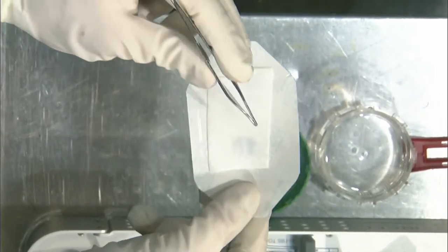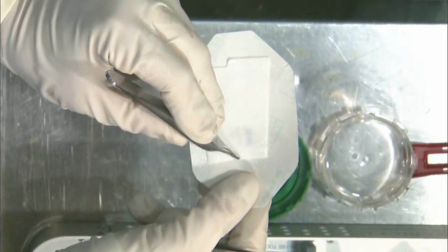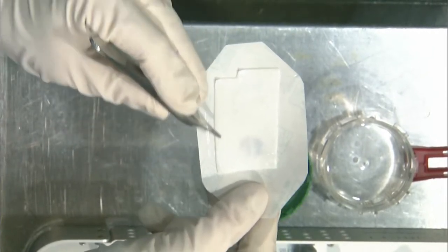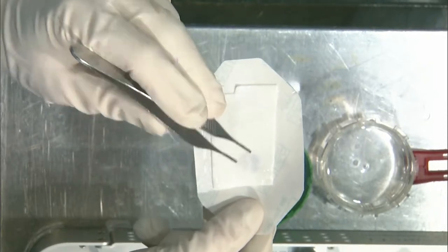That would not work. So putting it towards one side, not necessarily in the middle, and then keeping it just off of the edge. The cell populations right around the edge are not necessarily as viable as in the middle. So you just don't want it right on the edge. So you just bring it in just a hair there.